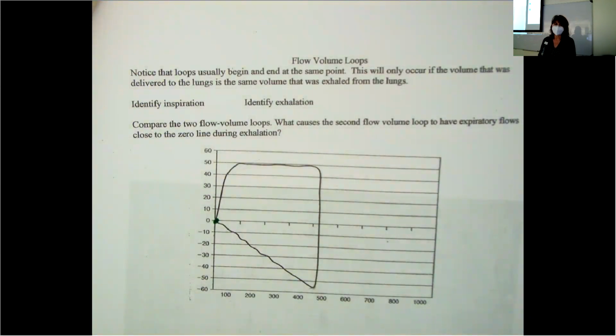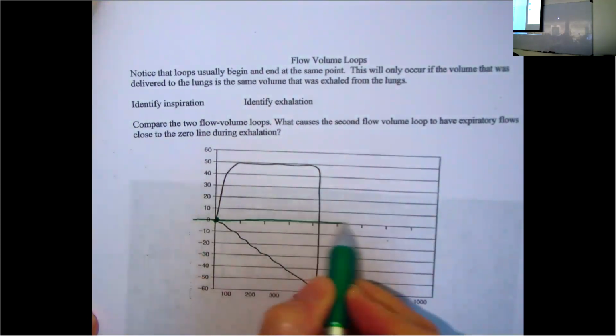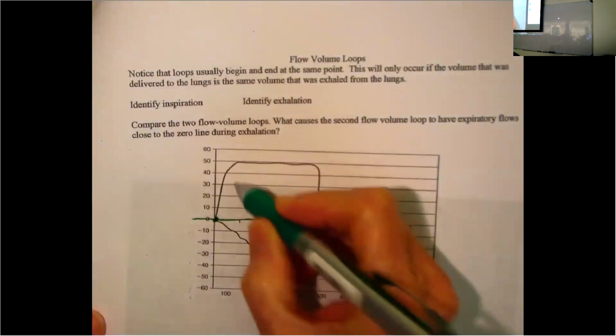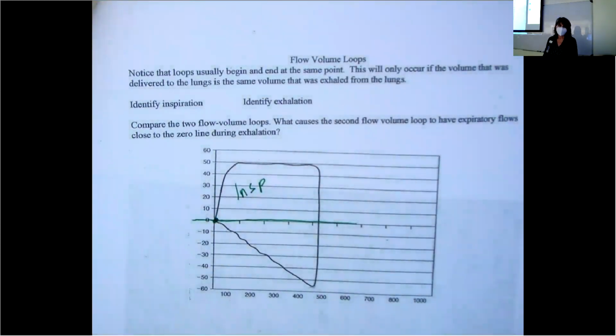Identify inspiration. Where is inspiration on this graphic? Right above the baseline or above that 0 line. That's all inspiration. And then below is exhalation.